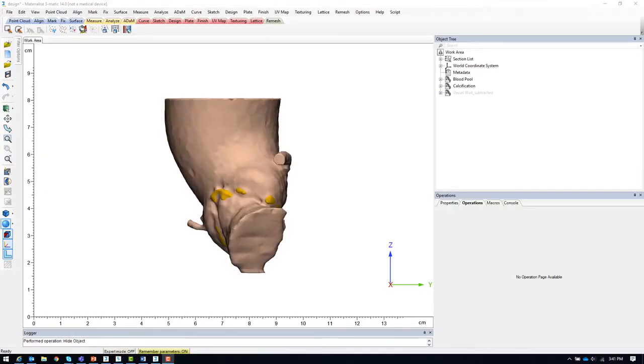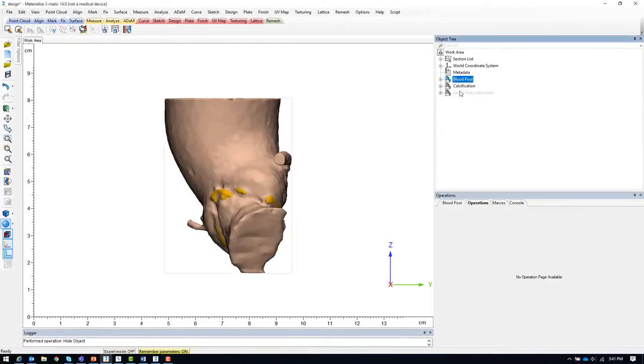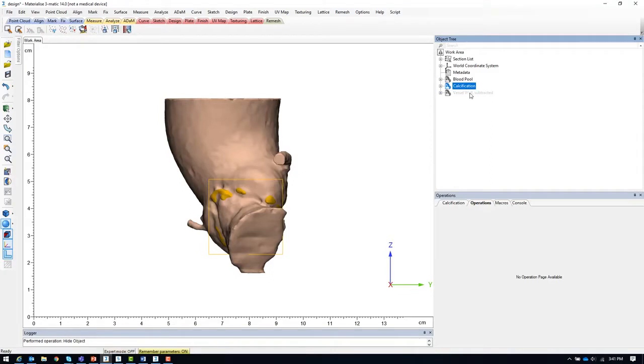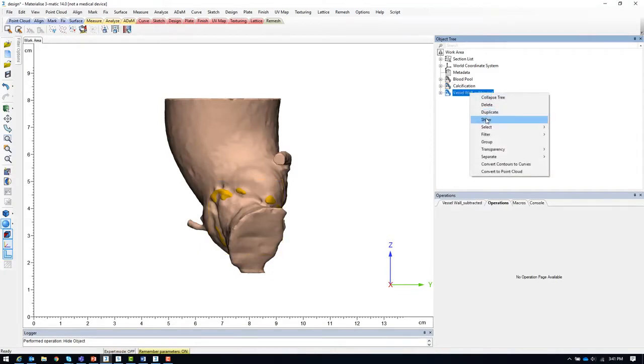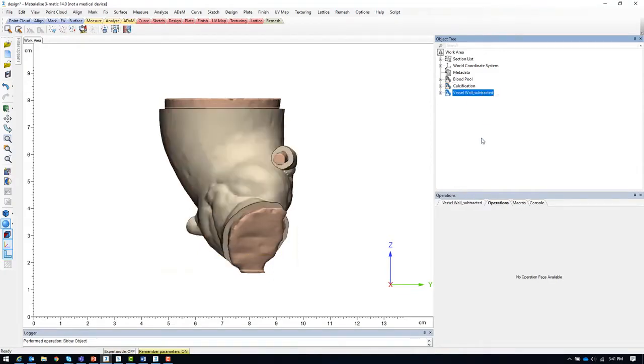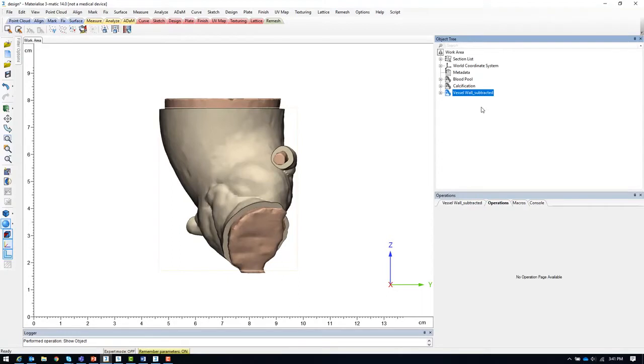Here I have an aortic root model example. I have already completed the segmentation of the blood pool and calcifications. In addition, I hollowed the blood pool and trimmed it to create a vessel wall model and finally subtracted the calcification to remove intersections between the vessel wall and calcification models.